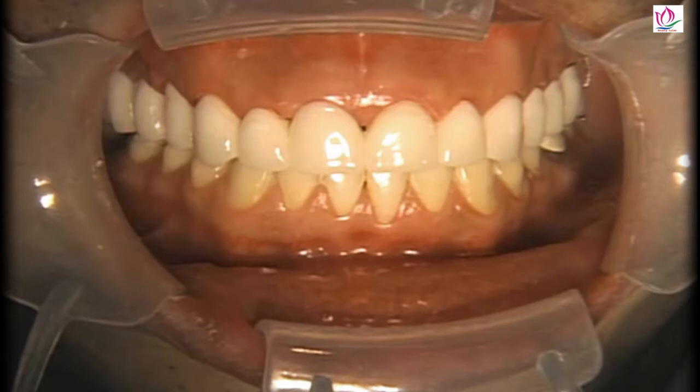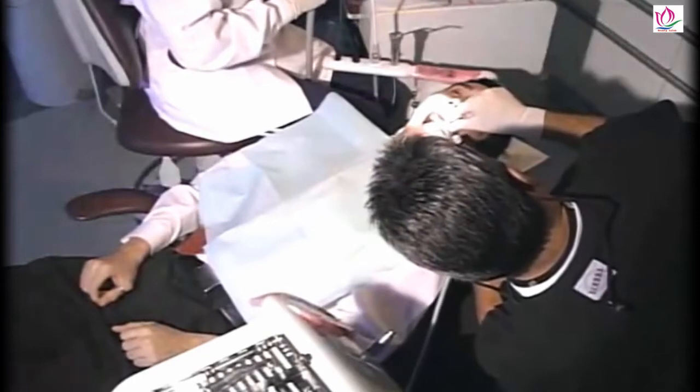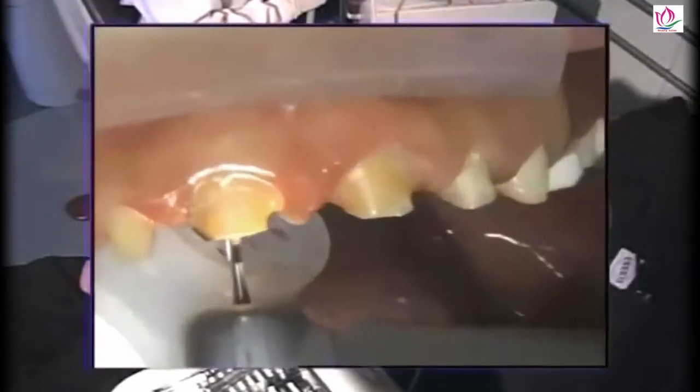There's a nice look at the biotemps when we're all finished and trimmed. Again, we want to leave the gingival embrasures open whenever possible to promote healing of the gingival tissues and to make sure that we don't cause any recession from having gingival embrasures that are too closed.